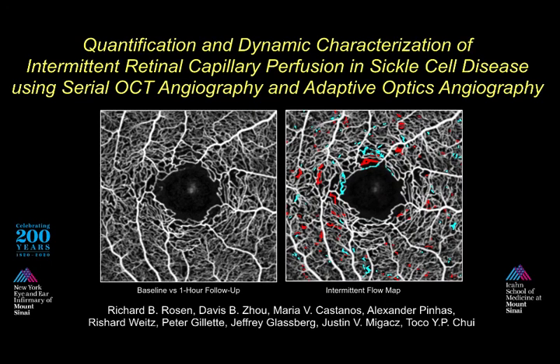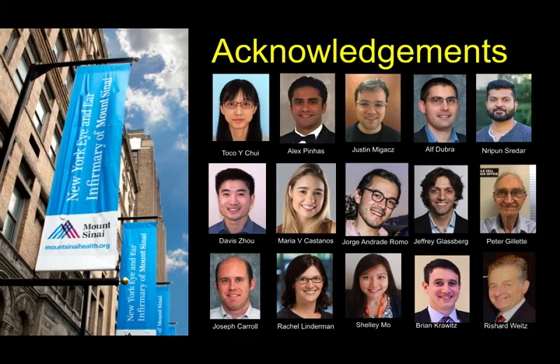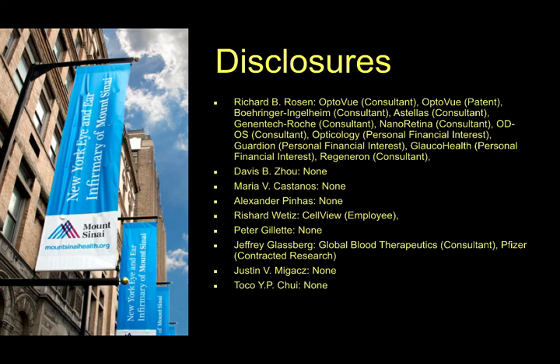Hello, I'm Richard Rosen, and today I'd like to discuss quantification and dynamic characterization of intermittent retinal capillary perfusion in sickle cell disease using serial OCT angiography and adaptive optics angiography. First, I want to acknowledge the many members of my team who made this presentation possible.